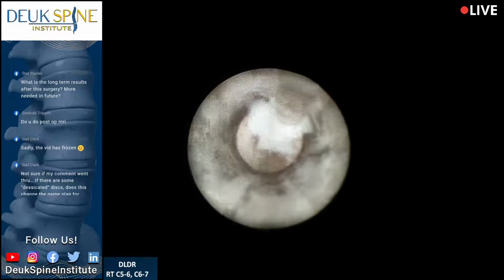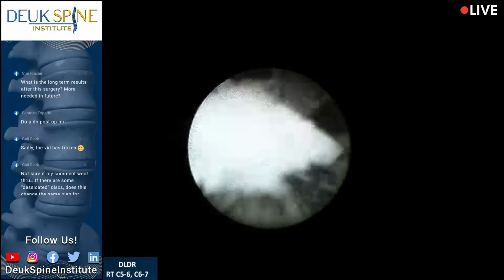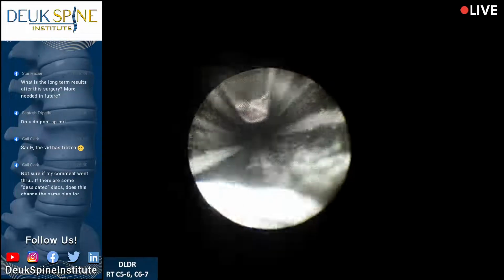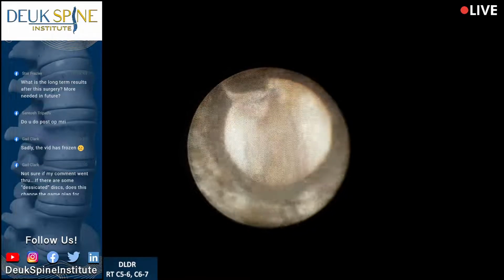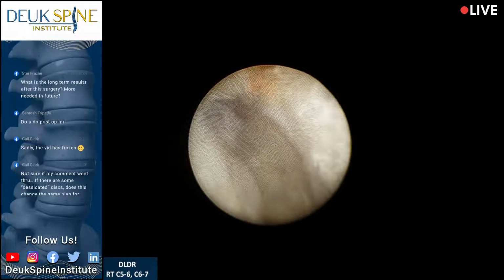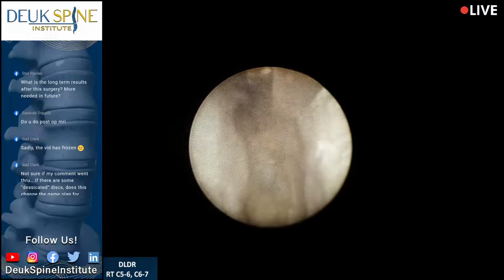Anyway, all right, Dr. Deuk Majan, we're just about done with the Deuk laser disc repair. We're finishing. That's another herniation, by the way. That's what they look like, little cotton balls. The laser is up there at 12 o'clock. You can see how it's used to release pieces of herniation. We wouldn't be able to do this surgery without the laser. There's no instrument small enough to do all this except for the laser. So the laser is essential.